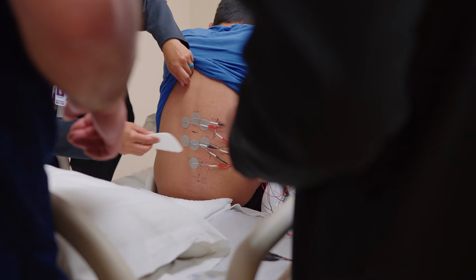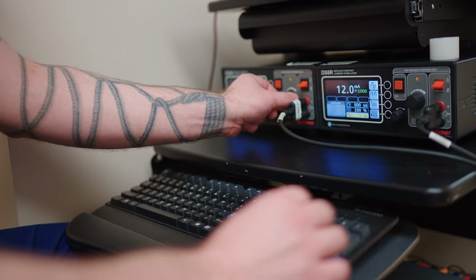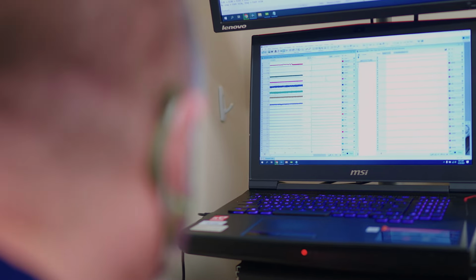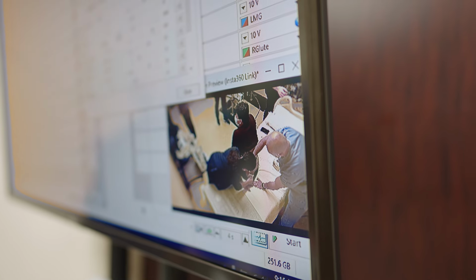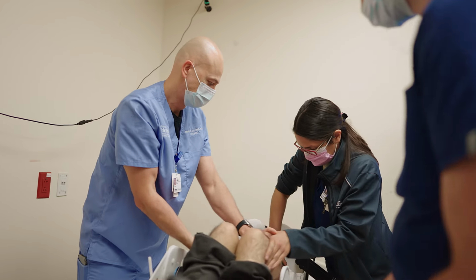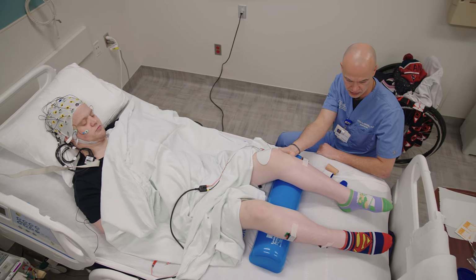The unique feature of our study was to add non-invasive spinal neuromodulation to this training to not only facilitate ambulation of people with spinal cord injury, but also to promote regeneration and repair in the spinal cord. During this trial, our team achieved establishing new parameters of stimulation. Most importantly, it's non-invasive spinal stimulation, so it is more achievable and can be used in a broader population.